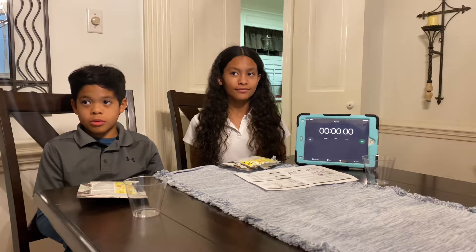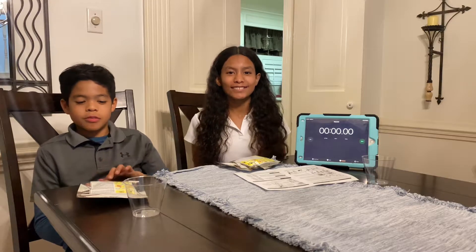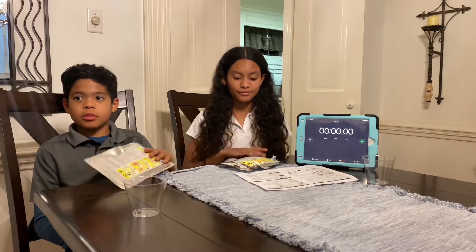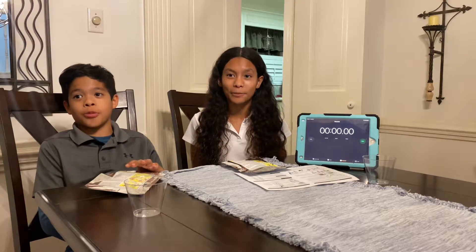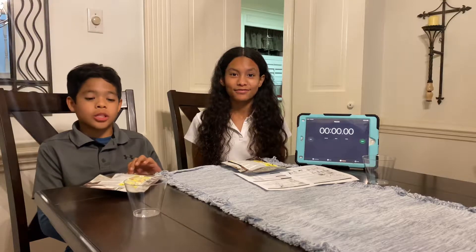Here we have LaBella and Gabriel. They're about to demonstrate how to use the oral rapid COVID test — right here. And the best thing about this test is what? You don't have to stick anything up your nose. So now let's jump right in.